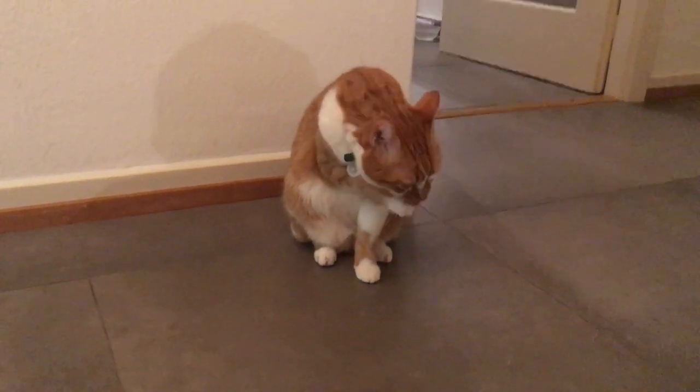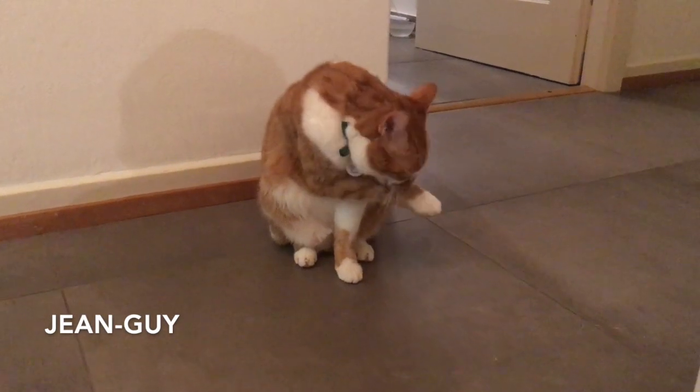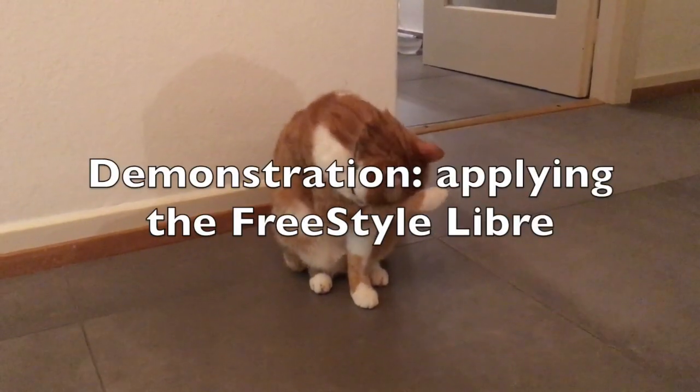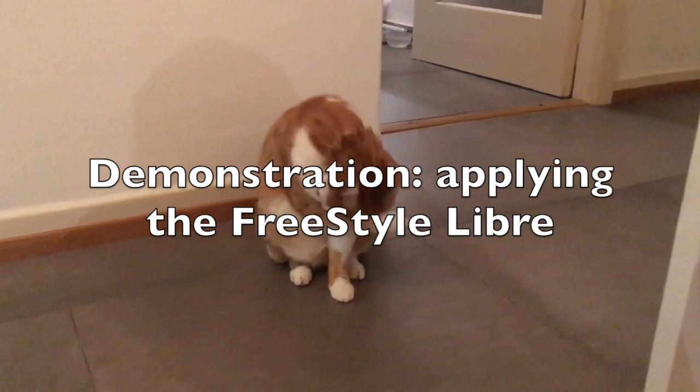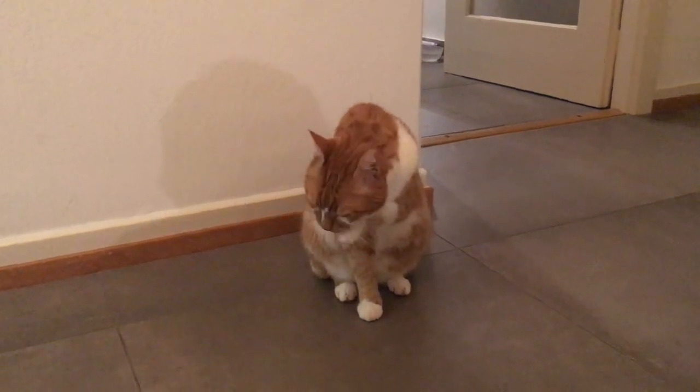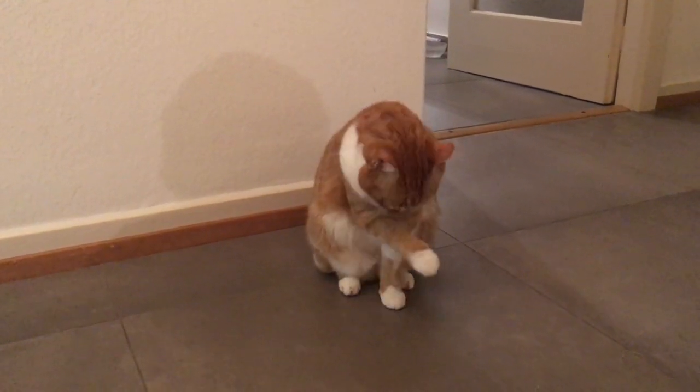Let me introduce you to Jean-Guy, who is going to be our model for this demonstration. We're going to apply a Freestyle Libre sensor on him so that we can monitor his glucose levels continuously.